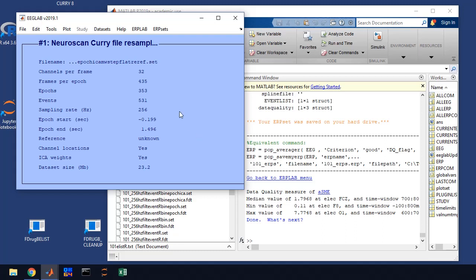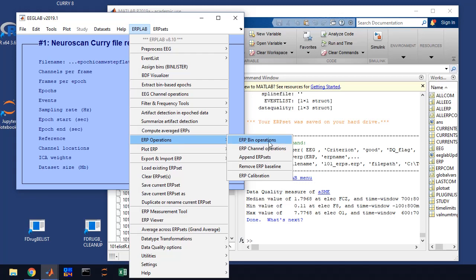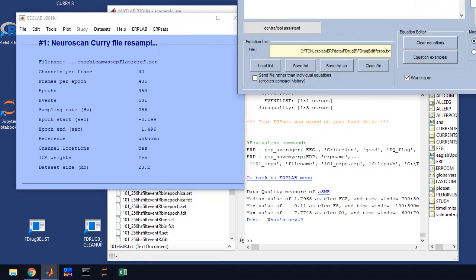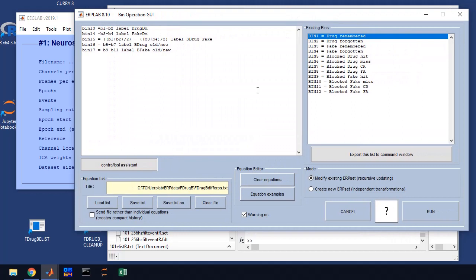So we now have our ERPs, but we're going to do some additional things, and in this case we're going to go to ERP Operations, ERP Bin Operations. A lot of times what we do is we create new bins based on the ERPs, and we can look at that, but we've got to create that bin.